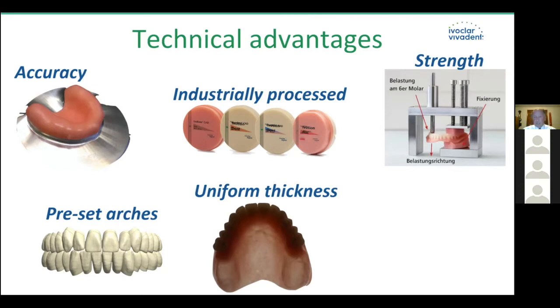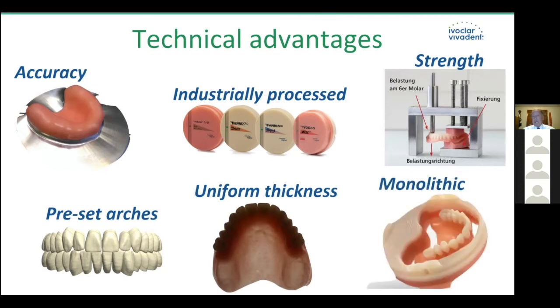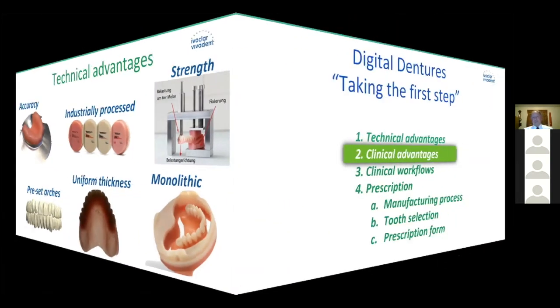There are two different processing methods. We're going to spend a lot of time on this particular one, and Rob started with that, the Ivotion disc. As mentioned, this is a solid disc, so you could imagine the strength of the material is as strong as it could be because it's totally monolithic. And we'll get into more detail of that as well.